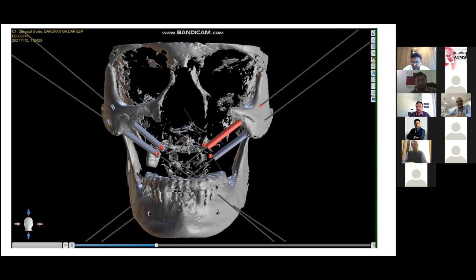As against that, the zygomatic implants that we place, conventional zygoma implants, they have two varieties. One has the rough surface, one has the smooth surface, the polished implants. With the help of guides, we can engage them, and it is a time-tested thing. That is the specific purpose of the conventional zygomas, that you can immediately load them also once you achieve the desired level of torque. There is a clear indication that you can go for immediate loading. Only that in these cases, because they are post-infective healing, we just try to give it time, and then we might go for a secondary reconstruction even after placing them.